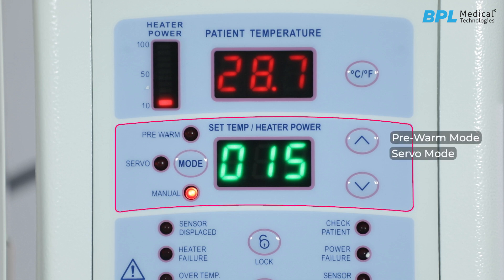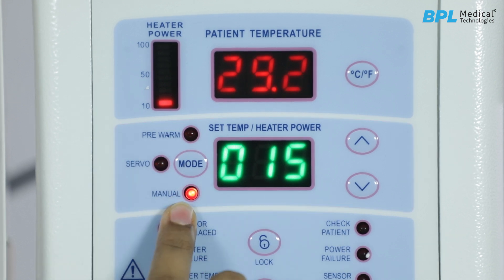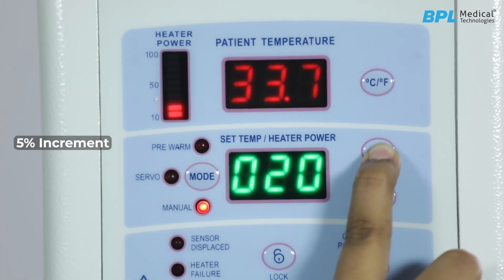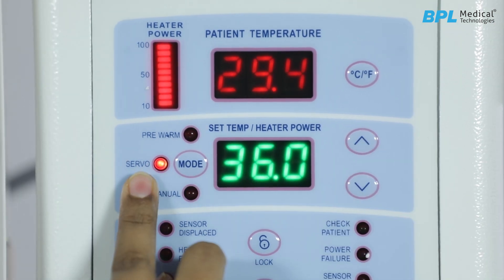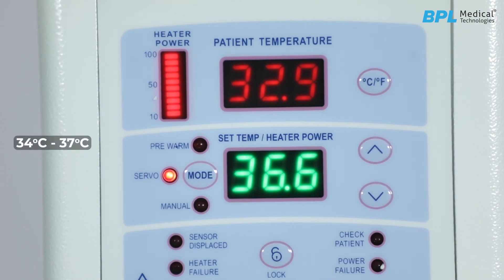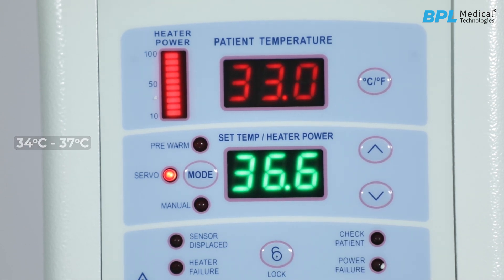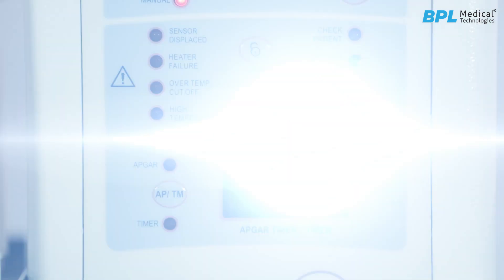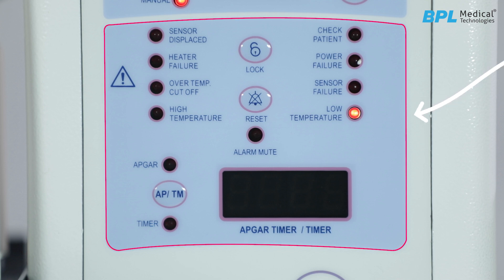In manual mode, the heater output is displayed in increments of five percent, giving precise control over the air temperature. Servo mode is used for monitoring the baby for a longer duration, with a normal required temperature range of 34 to 37 degrees centigrade. In pre-warm mode, during the first five minutes the heater output is at 100 percent, then reduces to 50 percent, and after 10 more minutes the machine automatically converts to servo mode.